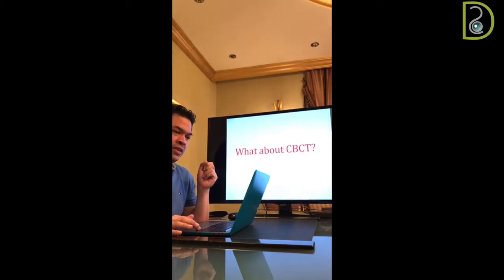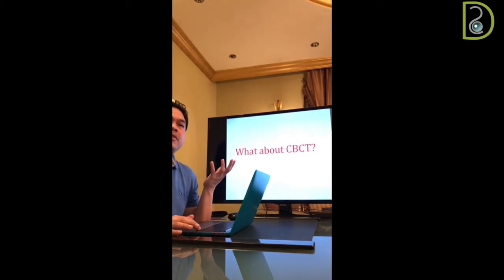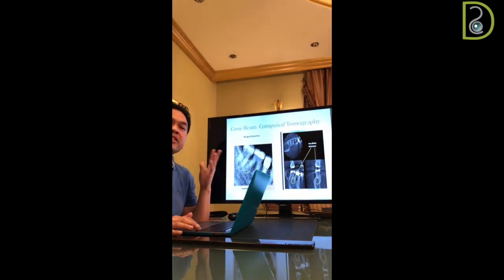What about CBCT? Is it very important to take CBCT? Actually, CBCT is very important, especially in cases of retreatment. It gives you very important information.